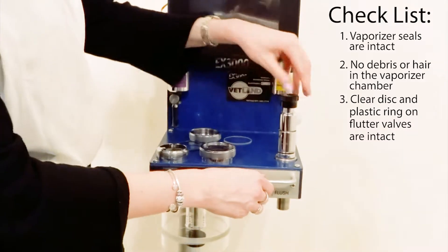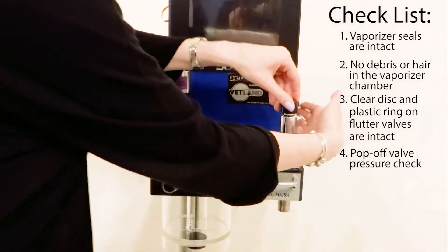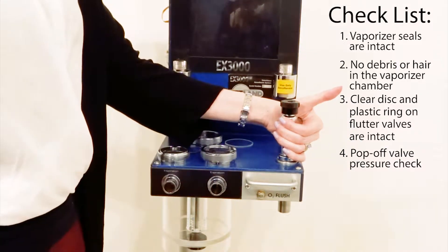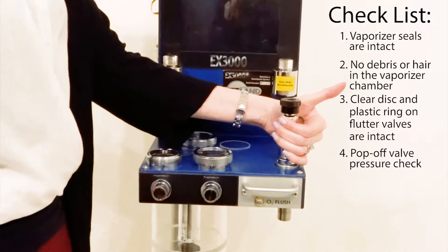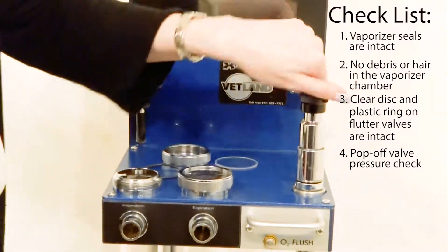Another area to check would be doing your pressure check on your machine. You can actually close your pop-off valve and hold your hand here. If you get a leak only when you're not holding there, it could be a leak inside of your pop-off valve.